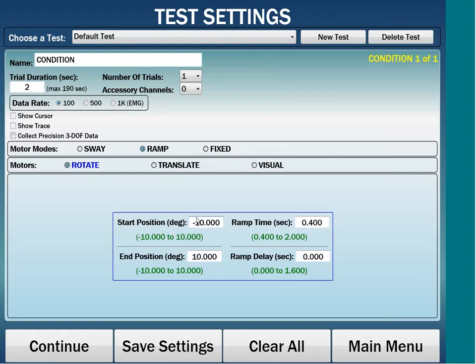So on to the case study. Today I will demo a case study in which we will focus on the effects of commercial space travel on balance. The original sensory organization research, which led to the invention of the Dynamic Balance Manager system, was performed on astronauts who during space travel were exposed to prolonged absence of gravity.